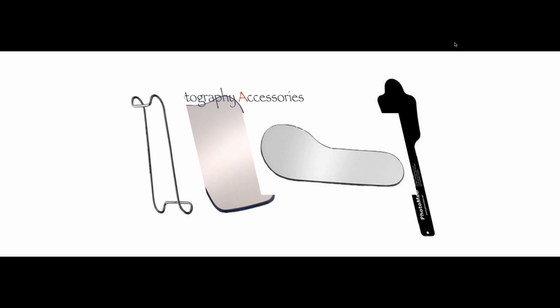Which accessories do we need in order to do dental photography? Well, we need retractors, definitely. We are going to need an occlusal mirror, like the one you see in the middle, and we're going to need a lateral mirror, I'm sorry, that is on the right side of the screen.